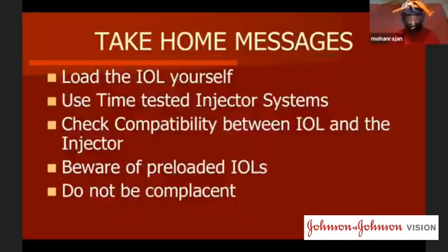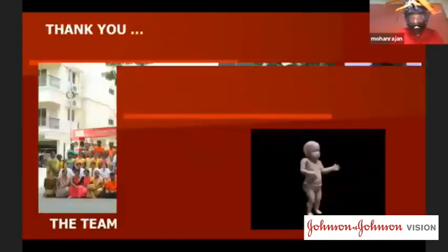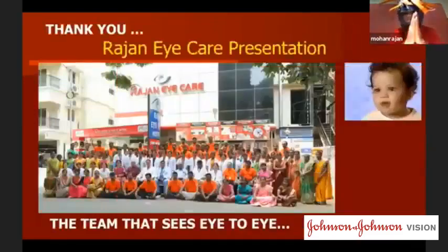Take-home message: load the IOL yourself, use the time-tested injector systems, check the compatibility between the IOL and the injector, beware of preloaded IOLs, do not be complacent, which normally happens when you're at the end of the surgery. And that is the IOL nightmares which I wanted to present. Thank you very much for the wonderful opportunity.